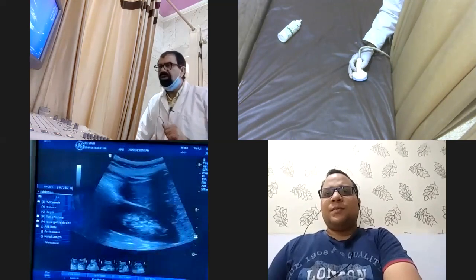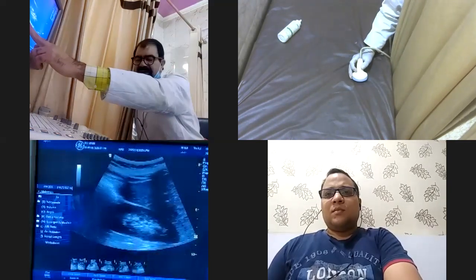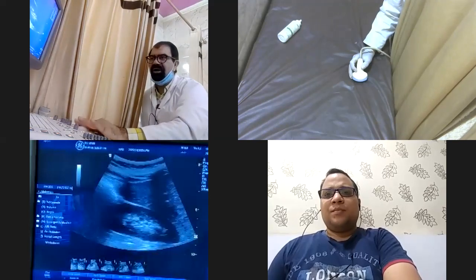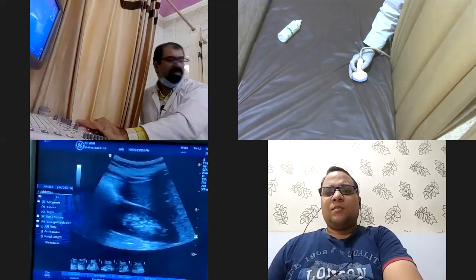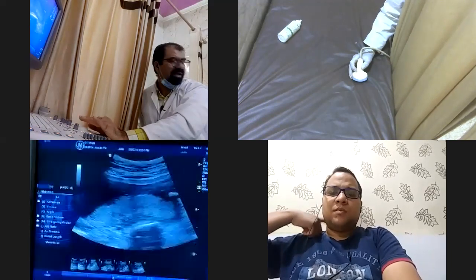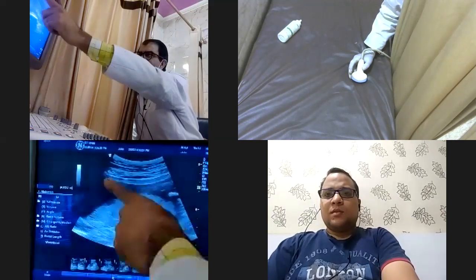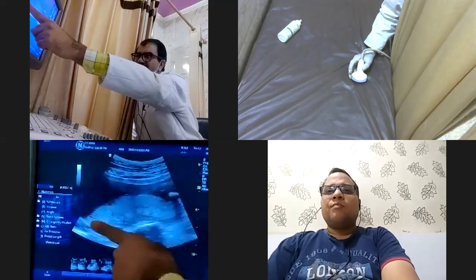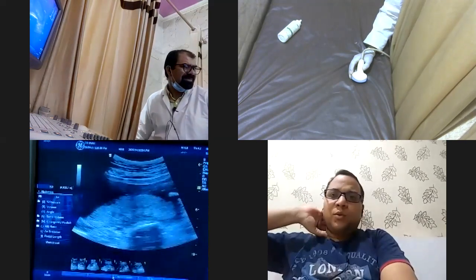Now, this is anterior and this is posterior. You know that now, right? Yes, sir. Now, I told you some minutes before that this is the placenta. Now tell me whether this is anterior placenta or posterior placenta. Sir, posterior placenta.